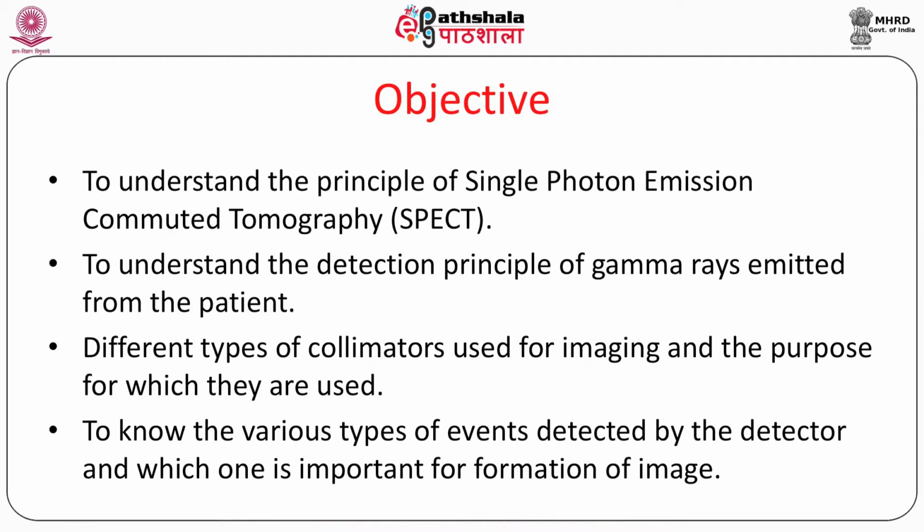The important thing to realize in the case of SPECT or normal X-rays is, when normal X-rays are taken, what exactly happens? It takes a snap. When it takes the snap, it gives only two-dimensional images, but our organs are in 3D shapes. In order to get a three-dimensional image, when we want to see it in all directions and know the depth of that particular disease, SPECT is a very useful device. And by different reconstruction techniques, you get an image. The image reflects functional information about patients.